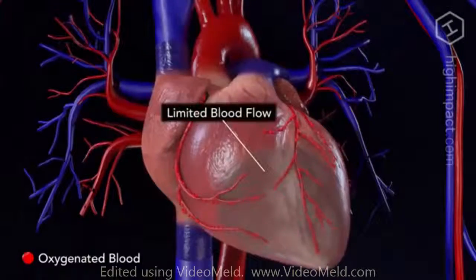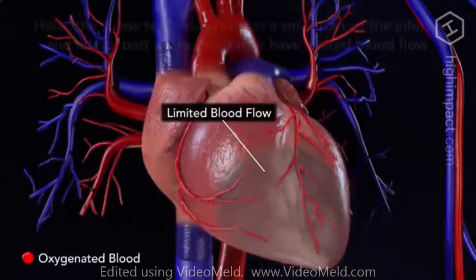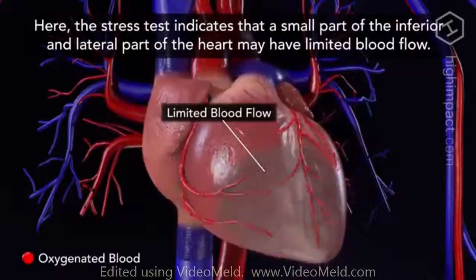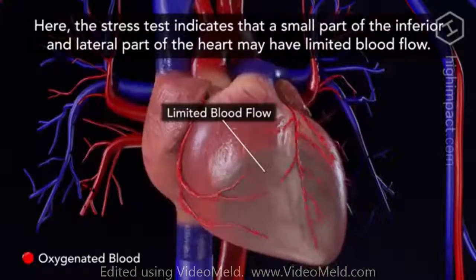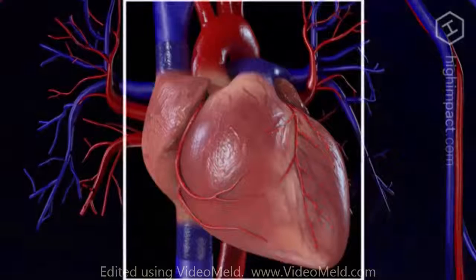When you arrive at the hospital, an intravenous line will be started. You will be placed on a heart monitor and you will be given an oral or intravenous sedative to help you relax. Most coronary angioplasty procedures last between 30 minutes and 3 hours.